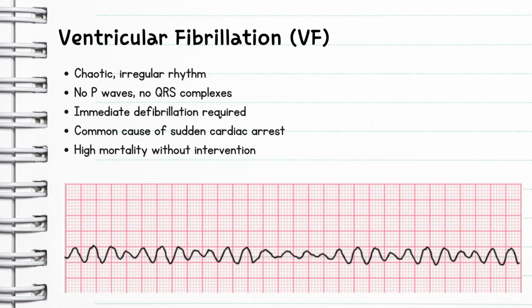Okay, so now let's start talking about the fun things, identifying rhythms. We're going to start out with the fun one. Ventricular fibrillation, which we also call VFib or VF, okay? So VFib is one of the most critical arrhythmias you're going to see and encounter as a nurse.